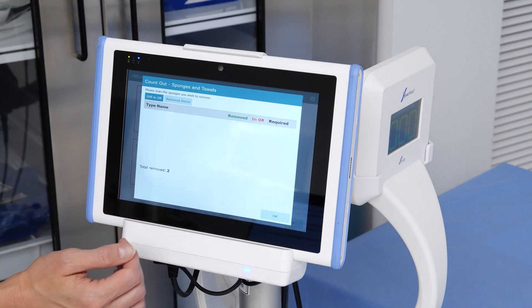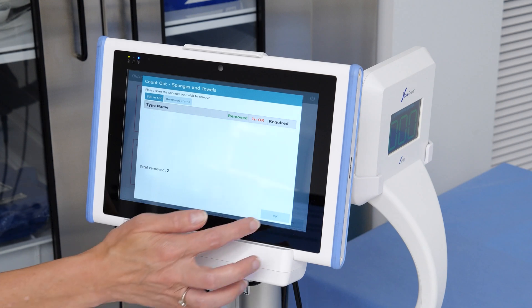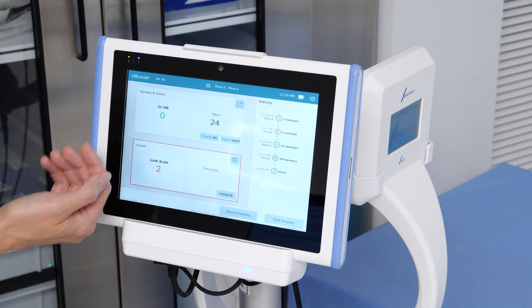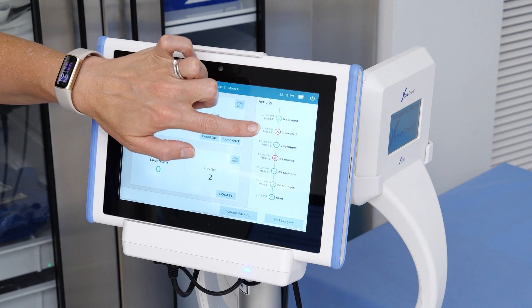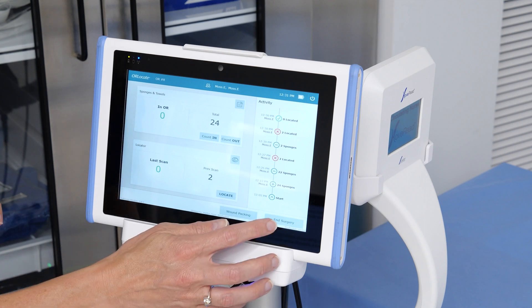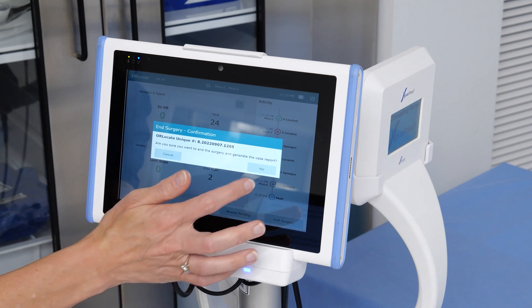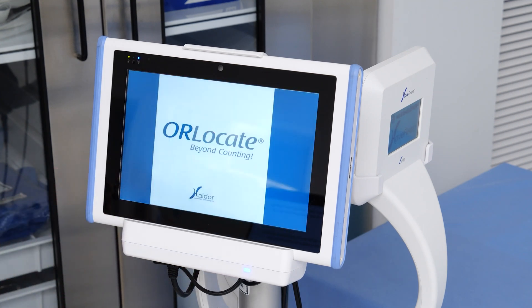Notice that all sponges have been removed from this surgical case. Finish the count out by pressing OK in the window's lower right corner. The sponge counts have now been reconciled and all case activity is listed in the activity window. With the sponge count out complete, press End Surgery to close out this case. An End Surgery confirmation appears — if everything looks correct, select Yes. The surgical case is now stored on the panel PC for future access if needed.